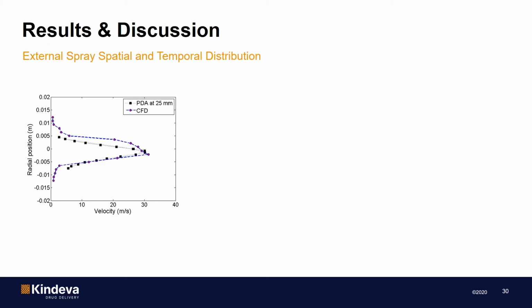And as you can see, there is a great agreement between the model predictions and our measurements. So both velocity profiles capture the Gaussian distribution very well. And as you can see, a velocity magnitude of around 30 meters per second exists around the center line of the spray.